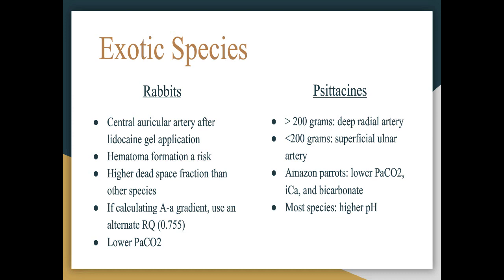Let us start with rabbits. The most important study evaluating rabbit arterial blood gases was performed in conscious dwarf lops that presented for castration. Arterial blood gases may be important as rabbits often hyperventilate or have altered respiratory status due to pain or abdominal diseases. Blood gases may also be important because rabbits may breath hold when nervous, which can complicate your findings. And pulse oximetry is often unreliable in rabbits.